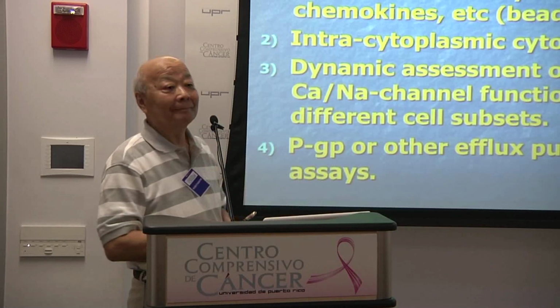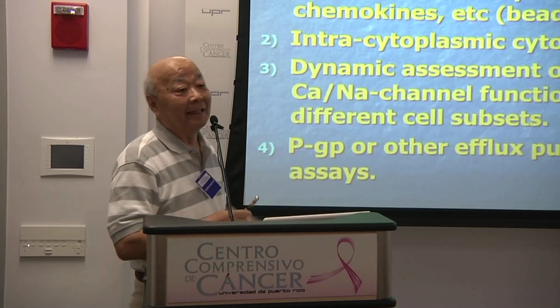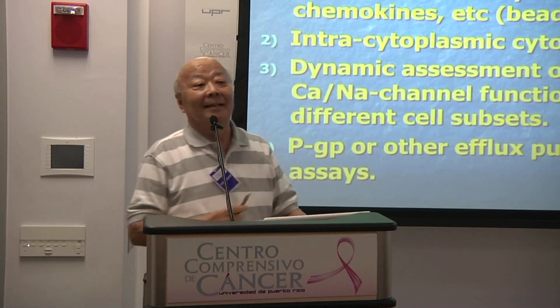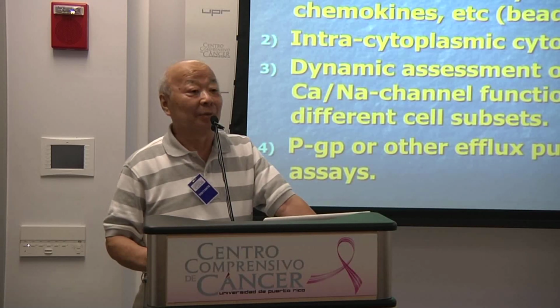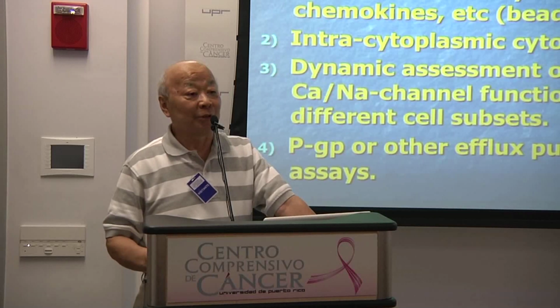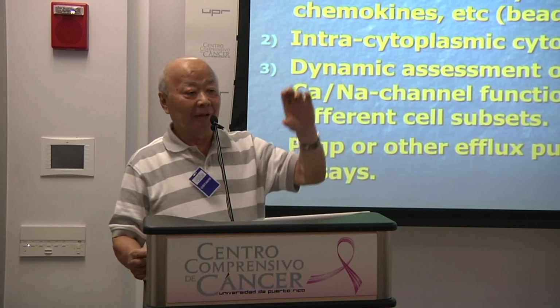What's the minimum number of copies that the homebrew test detects? With the viral load, it's really how you run the sample. If you have an elaborate sample concentration procedure, it's not really the assay, it's the sample concentration procedure.